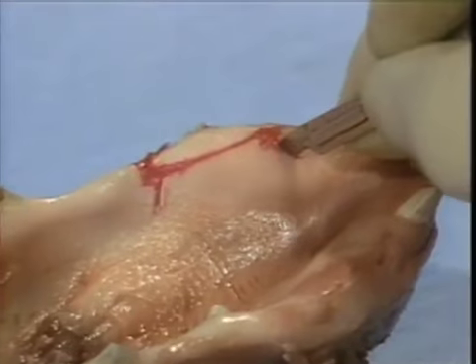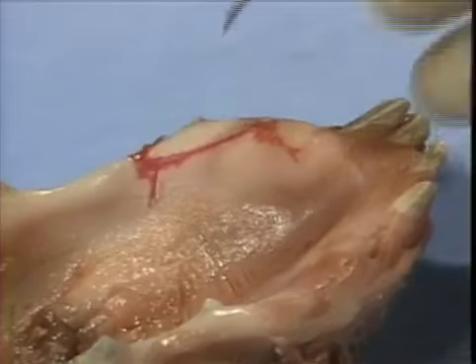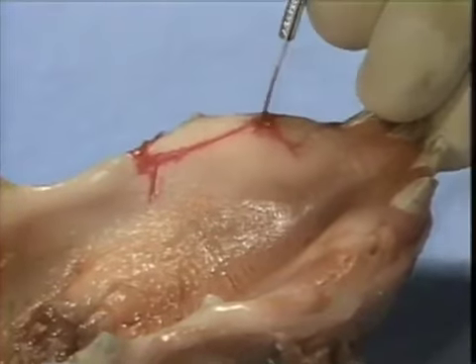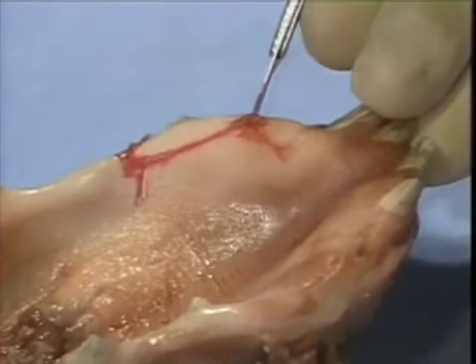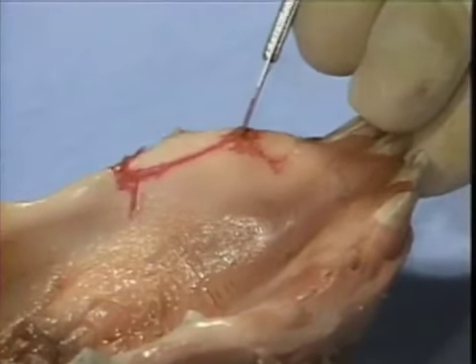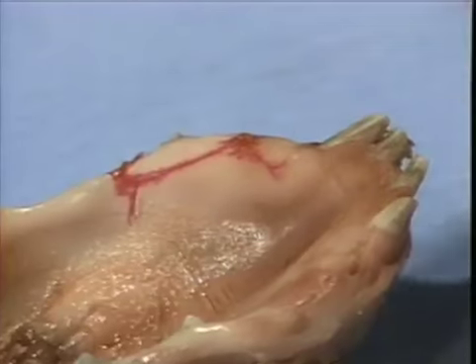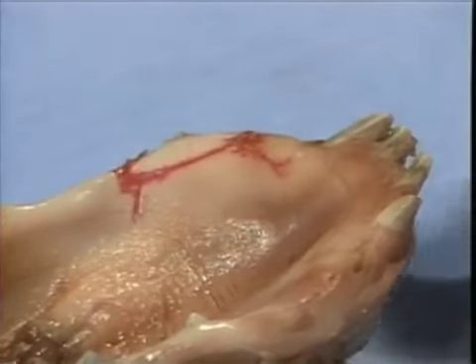We will place vertical releasing incisions both on the distal and mesial of the buccal and lingual flaps. These incisions again are placed through periosteum in a continuous nature.